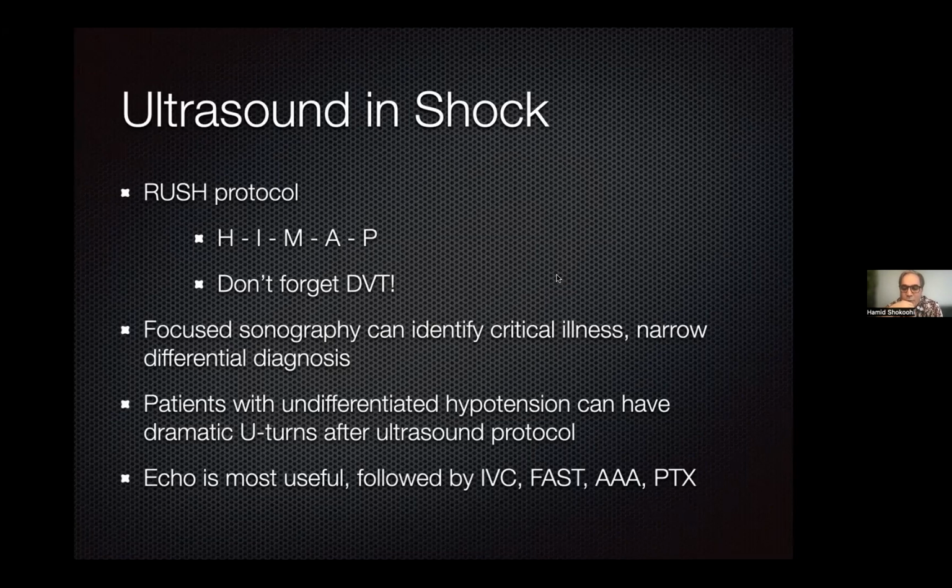This protocol is helping with patients. I can say normally about 50% of the cases is significantly impacted, about 20% is moderately or a little bit impacted, and in 30% of the cases there is really no impact from the ultrasound. But you cannot differentiate which one is which unless you're doing it.